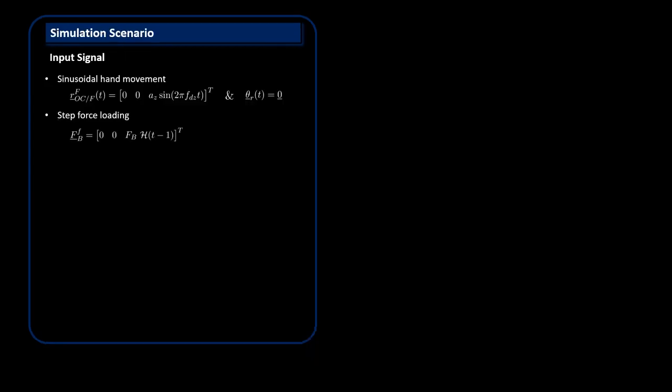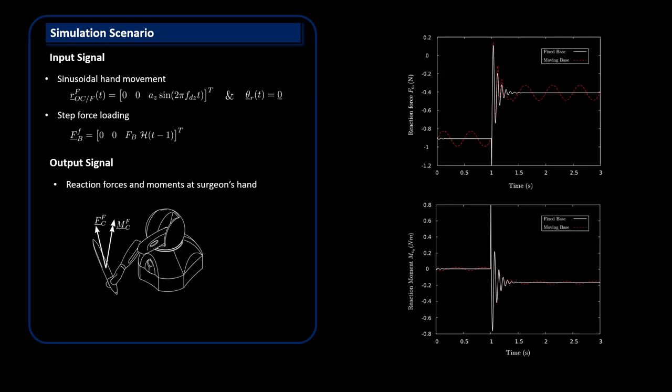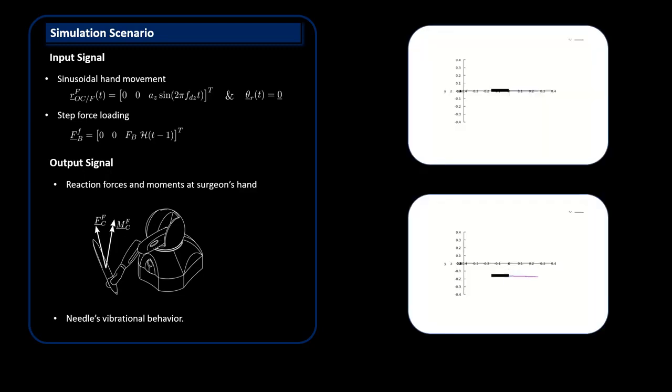To illustrate the performance of the proposed model, we considered a simple test case of step force loading. The system response was examined for both a fixed and a moving base. The results show that the proposed model captured the dynamics of the needle's vibration while accounting for the inertial forces and moments caused by the overall rigid body motion. Next steps will include the experimental validation of the proposed model.